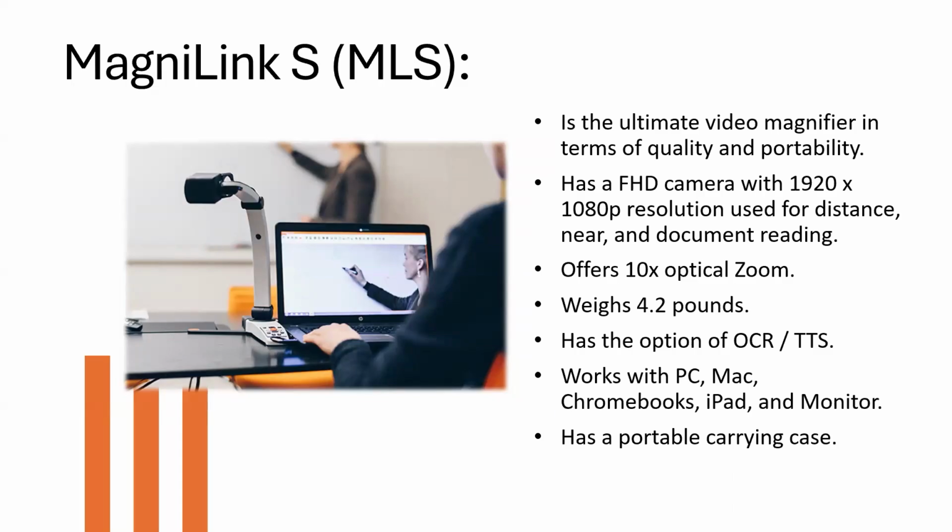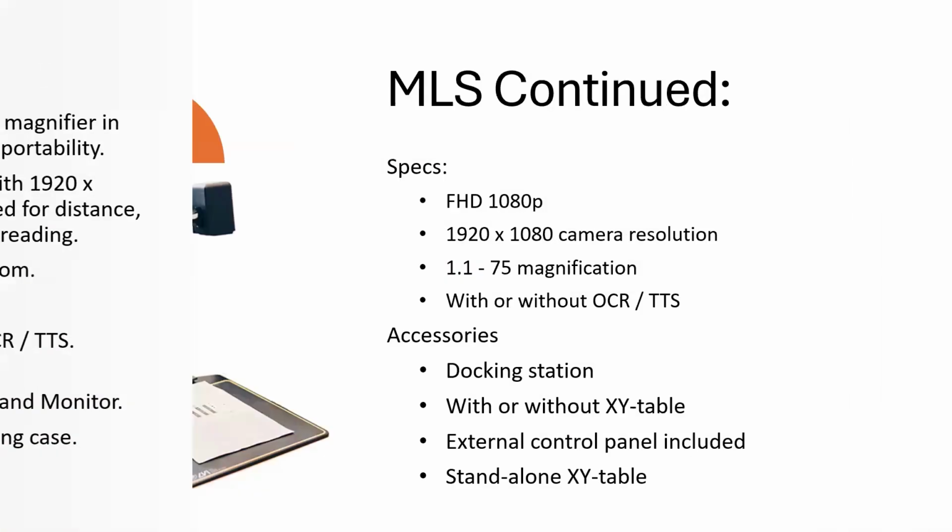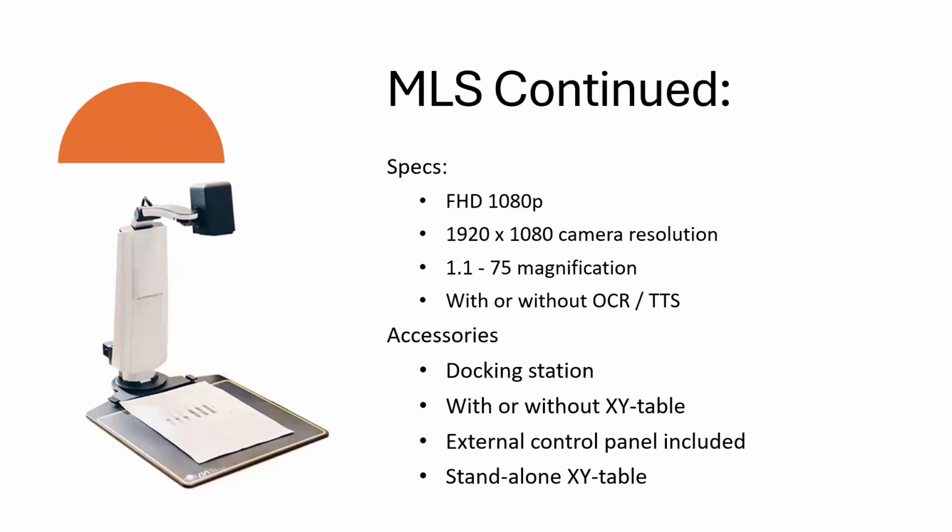In the picture, we have it connected, as I mentioned, to a PC, and it's actually focused across the room looking at a board, and you can see the teacher's actual hand up on the whiteboard, and that's magnified up on the screen, which is really, really cool. The MLS, as I mentioned, I call it the super product.